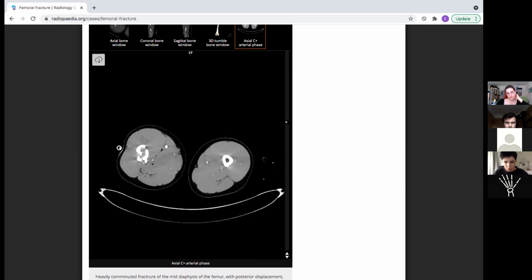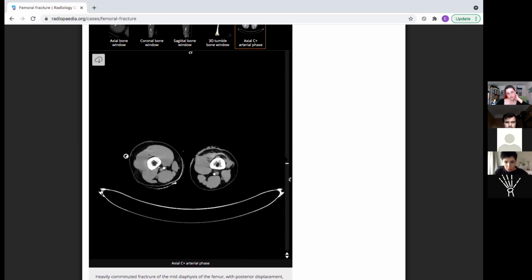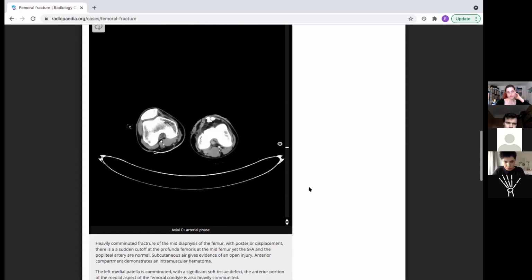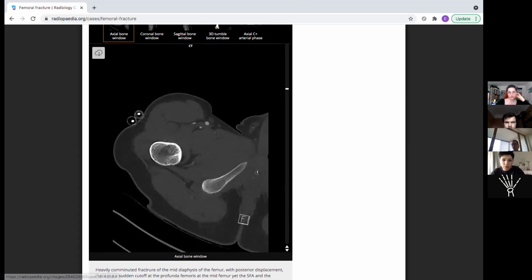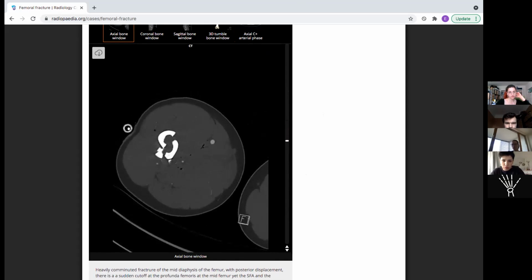So I'm going, okay, we have to go down. At the patella, so here, there's another fracture. Here you see the patella, and on the lateral condyle, yeah. So basically that's it. I can comment that sometimes hematoma is better seen on native scans, not with contrast, because hematoma is usually hyperdense, as there is blood.